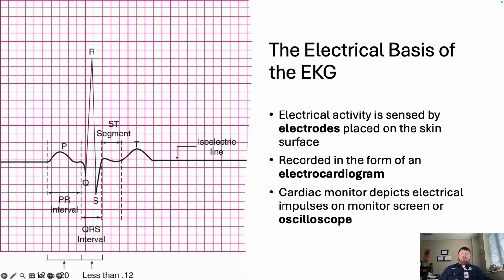So one thing that we need to do is understand that the electrodes are going to be your stickers, all right? So your stickers are going to hook up to your cardiac leads. Your leads are going to be your electrical wires, and your basic 3 lead is going to be your salt, pepper, your ketchup, and then the green, the grass, or whatever you want to call it.